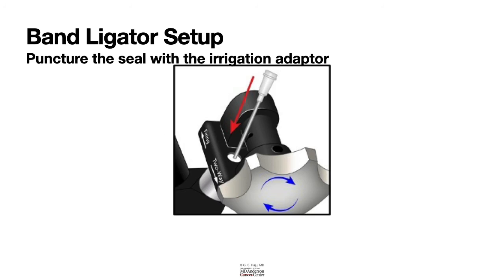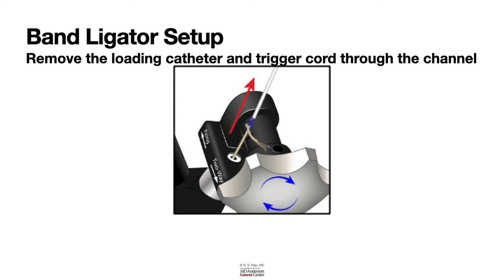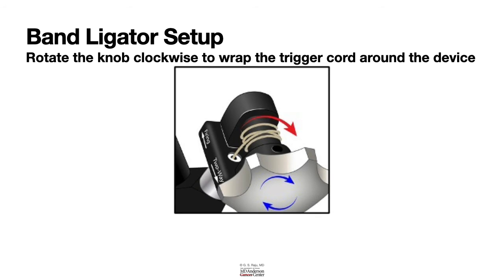So you puncture the seal with the irrigation adapter and insert the loading catheter into the channel and push it till the loading catheter comes out of the endoscope. And then you take the trigger cord and attach the trigger cord to the loading catheter and pull the loading catheter back to remove the loading catheter and the trigger cord through the channel, and load the trigger cord onto the notch on the device, as you can see here, and anchor the knot onto the groove, and then rotate the knob clockwise to wrap the trigger cord around the device.